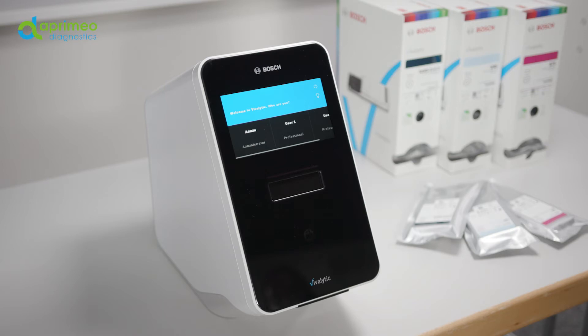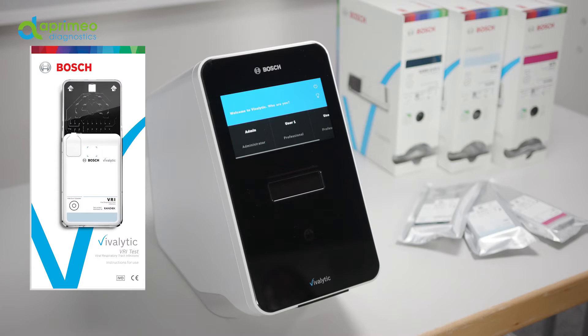Please get the cartridge ready for the test you want to conduct. For a detailed description of the type of sample you need, the exact preparation and the required sample amount, please refer to the respective test-specific user guide. In case you don't have it at hand, you can also download the current version from our website at the user services area.